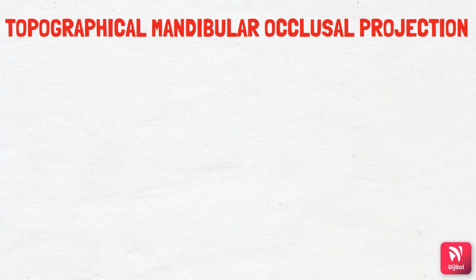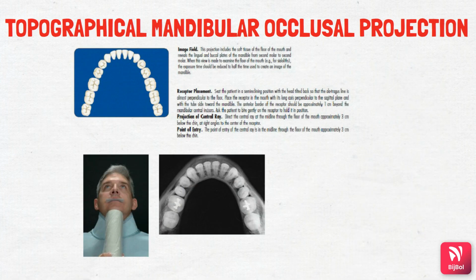Next is topographical mandibular occlusal projection. Seat the patient in semi-reclining position with the head tilted back so that the ala tragal line is almost perpendicular to the floor. Place the receptor in the mouth with its long axis perpendicular to sagittal plane and with the tube side towards the mandible. The anterior border of the receptor should be approximately 1 cm beyond the mandibular central incisors. Ask the patient to now gently stabilize the receptor.